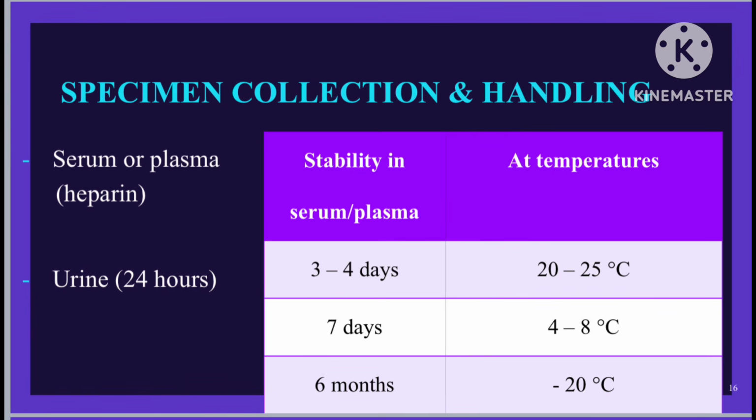If you happen to run samples for 24-hour urine in the determination of uric acid class, in order to prevent the precipitation of uric acid, you have to add 15 ml of 5 moles per liter of sodium hydroxide into the urine collector to ensure that urine pH stays at greater than 8. You have to dilute urine samples in 1:9 ratio with distilled water and multiply the results by 10. If ever the urine samples are contaminated, you have to discard them.